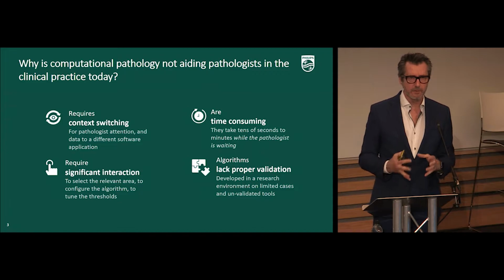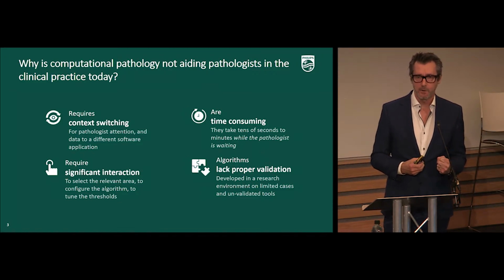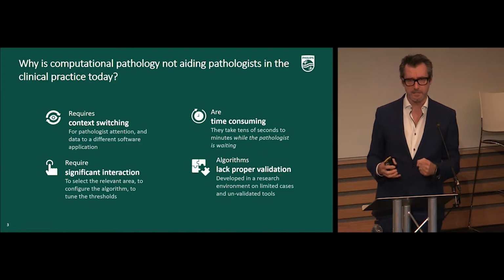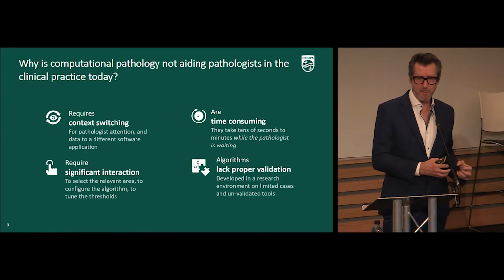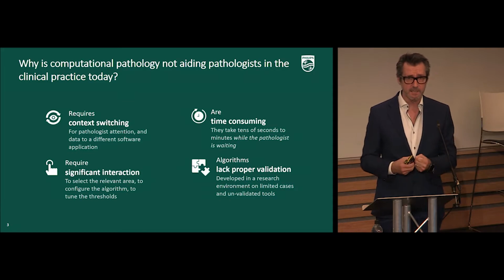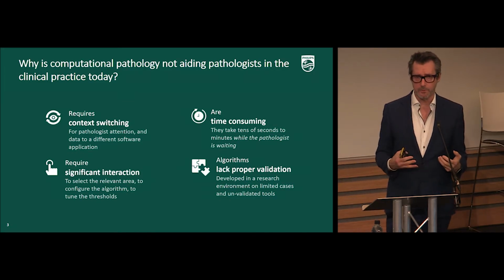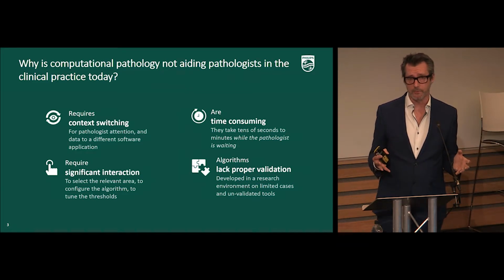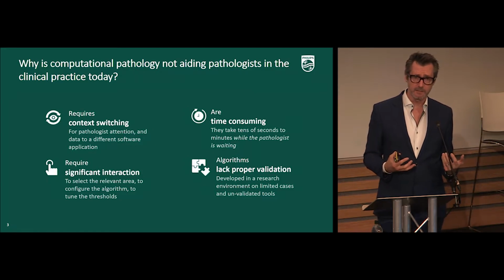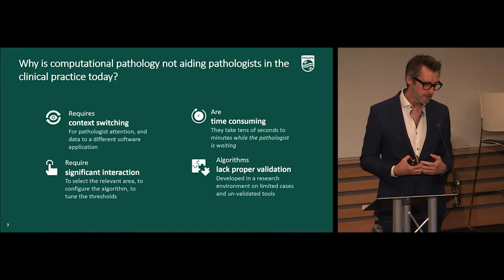And to be able to take those types of solutions and use them in routine diagnostic practice requires shifting of context, asking the pathologist to take the images that they're looking at routinely, load them up in a different software platform, begin to apply algorithms with it, and then take that data in a meaningful way and use that for routine diagnostics. And that stepping out of that routine workflow, and that context shifting is not convenient and doesn't make it easy for pathologists to adopt these technologies.